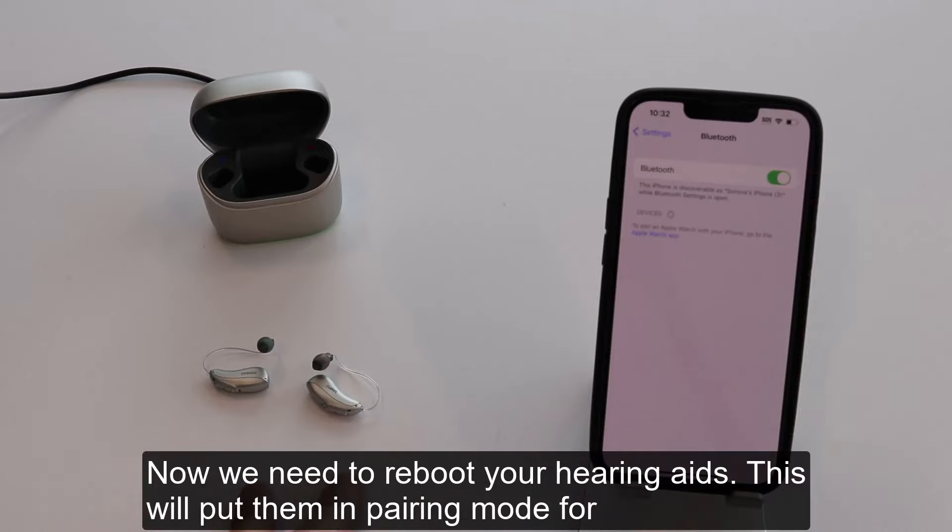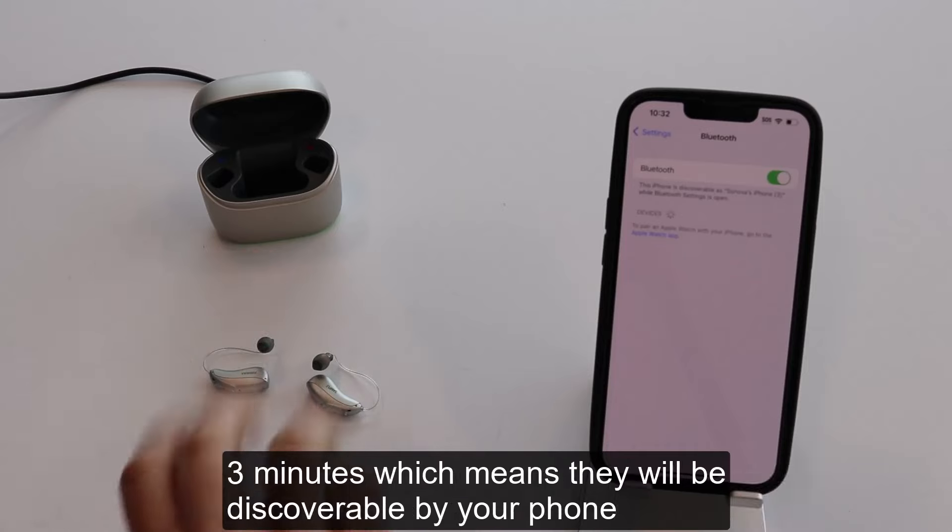Now we need to reboot your hearing aids. This will put them in pairing mode for 3 minutes, which means they will be discoverable by your phone.